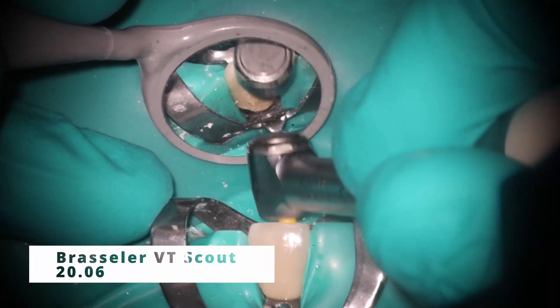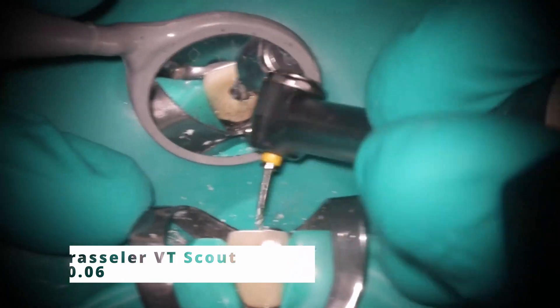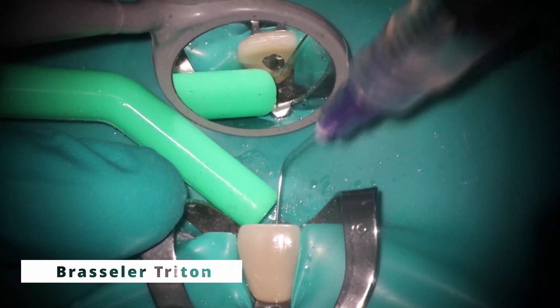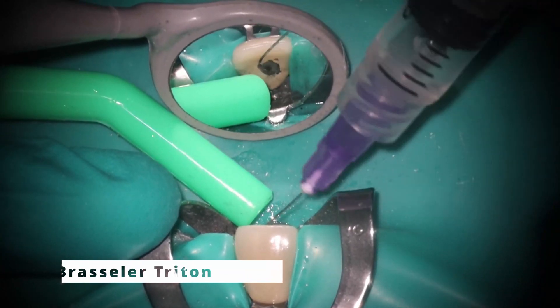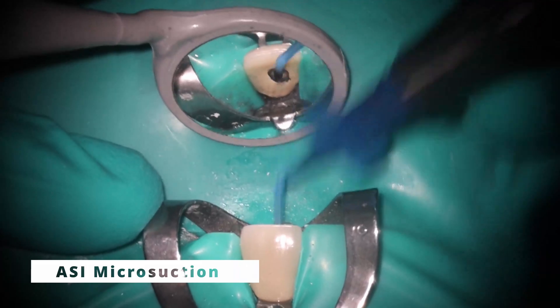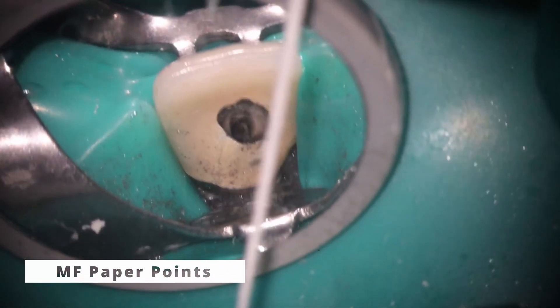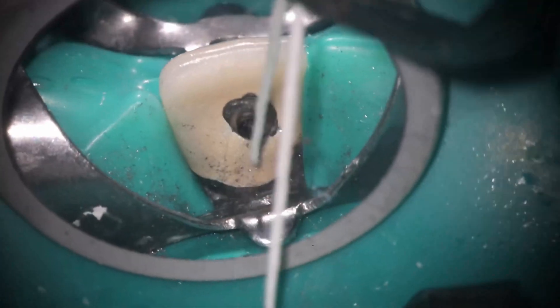After you've done this, go back in with a larger file. In this case I used my 20/06, and you can see how much brushing that does — it loosens up those pieces. Then after that, rinse thoroughly and make sure you dry it. When you go back in, you'll see with these paper points there's no more visible pulp stone, and most importantly they're coming out nice and straight.